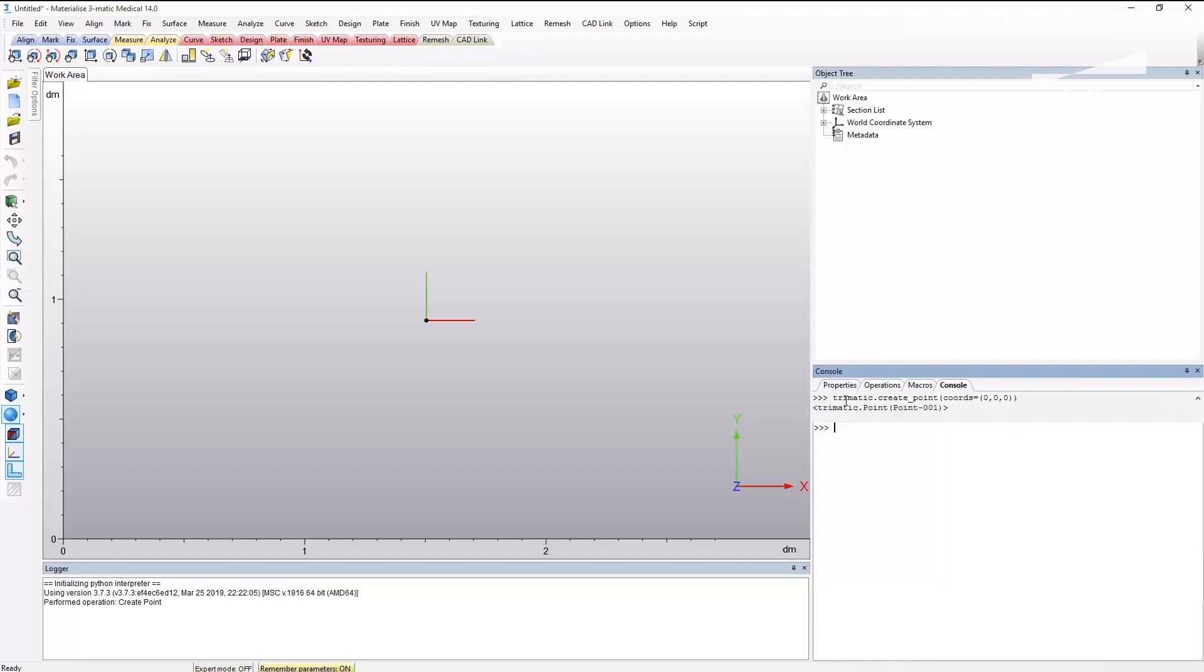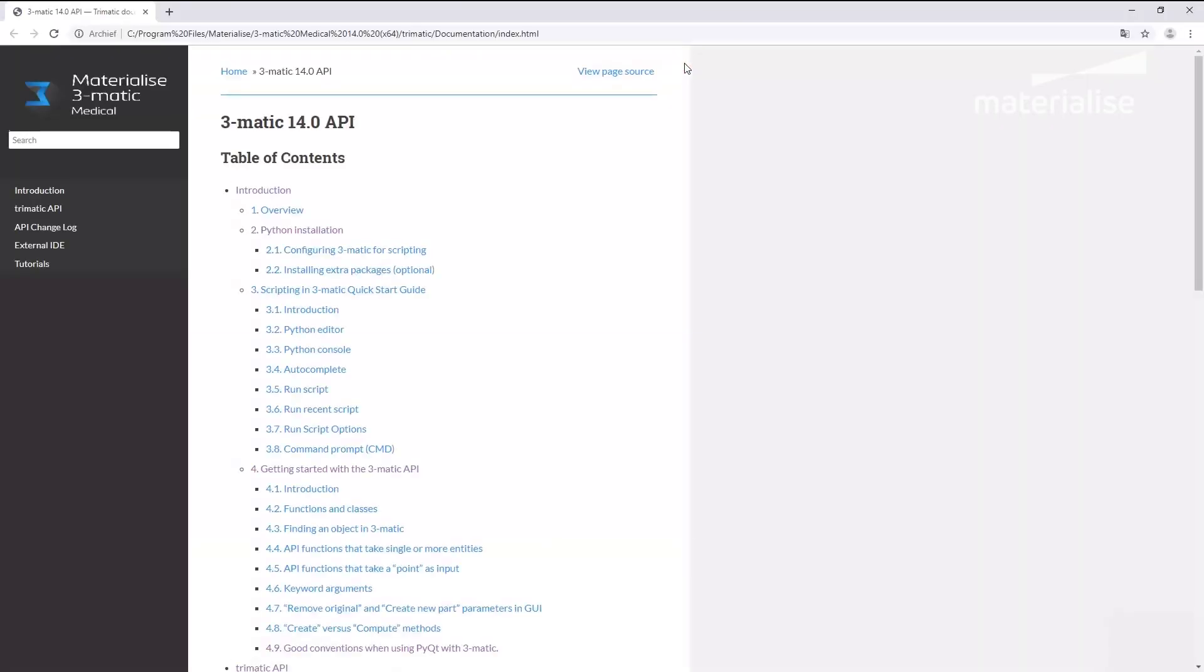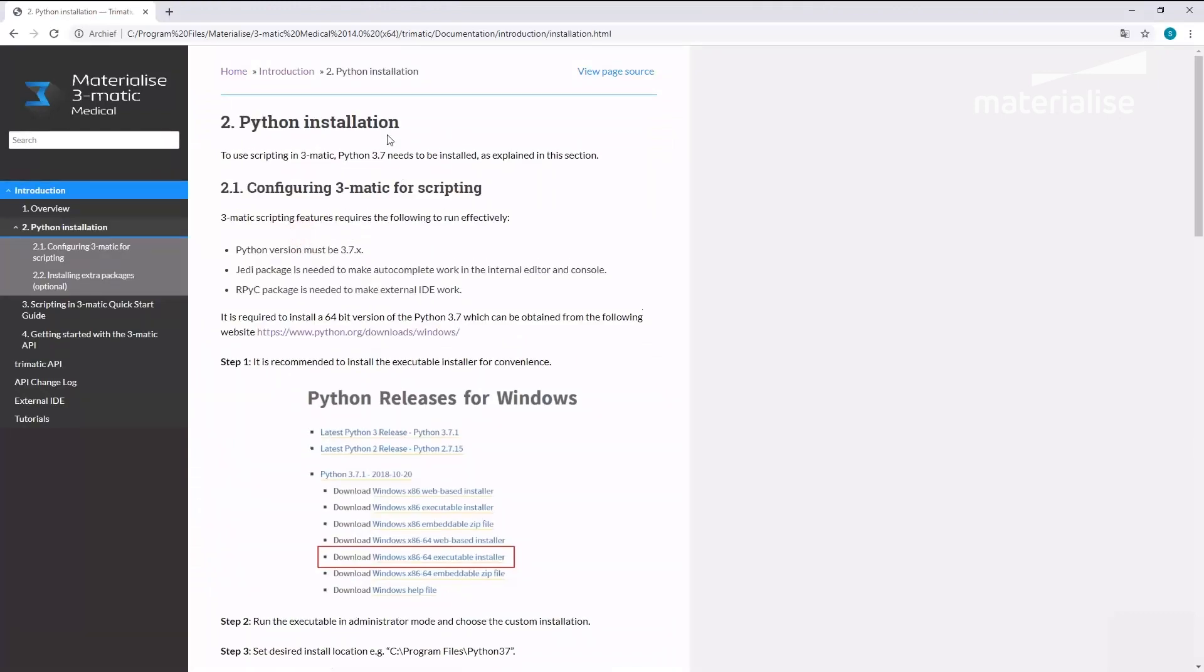Congratulations! You are now ready to script your workflow. For further information about scripting or Python installation, you can refer to the Materialize 3-matic scripting guide.